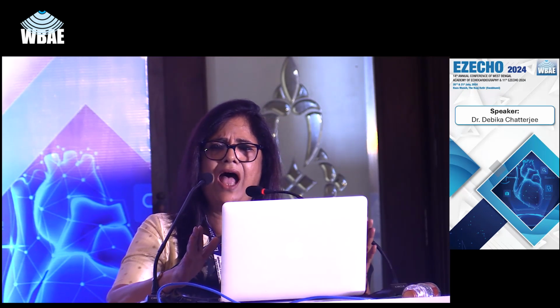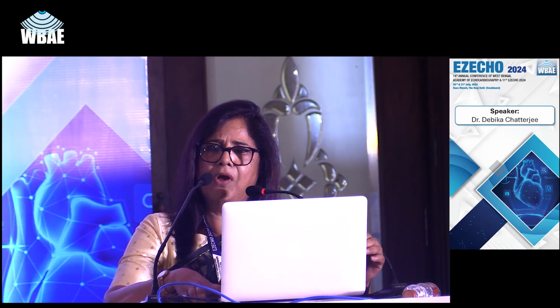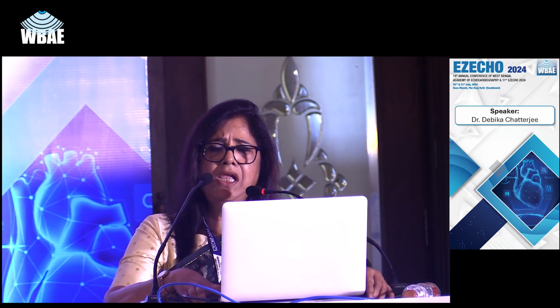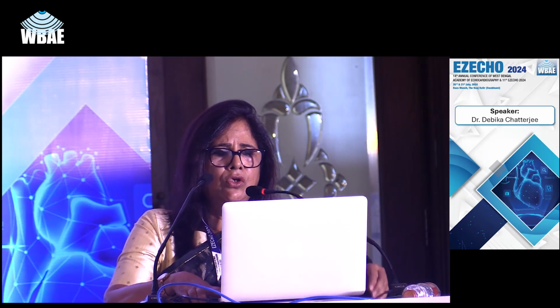Hyperdynamic LV, high ejection fraction, doesn't mean the patient will have a high stroke volume. It is the LVOT-VTI which is the surrogate for stroke volume. So we measure the LVOT-VTI from the apical 5 chamber or apical 3 chamber view, keeping the sample volume in the LVOT within 1 centimeter of the aortic valve. The normal value is 15 to 20 centimeters, whereas in this case it was very low. LVOT-VTI can also be used for follow-up of fluid responsiveness in these patients.